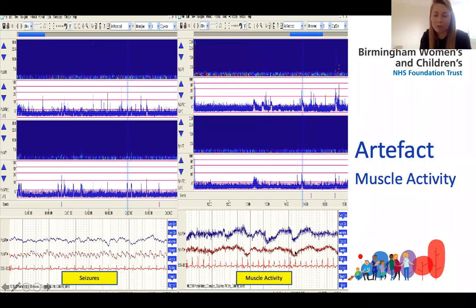And so without the raw EEG giving us information, you can see that this looks very fuzzy. You're getting this fast muscle activity that's coming on top of the normal EEG waveforms down here. And that's the giveaway that this patient isn't muscle relaxed. But without that, it would be very obvious, or we would like to think this is obvious because we're telling you that upward deflections in amplitude are seizures, to want to treat that.